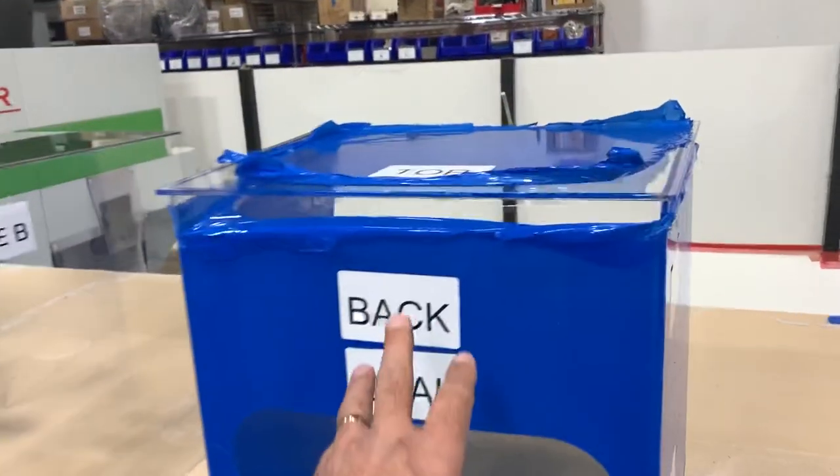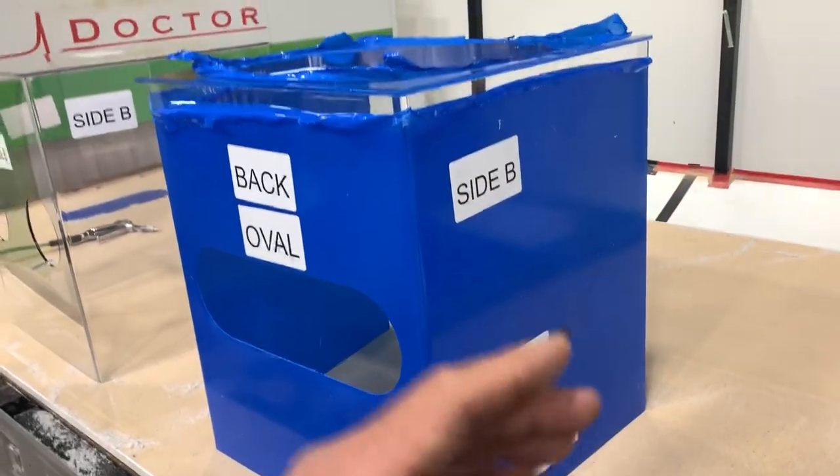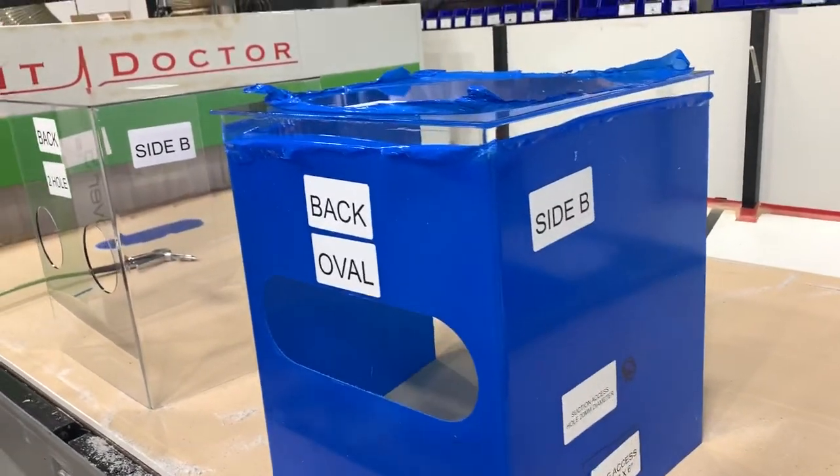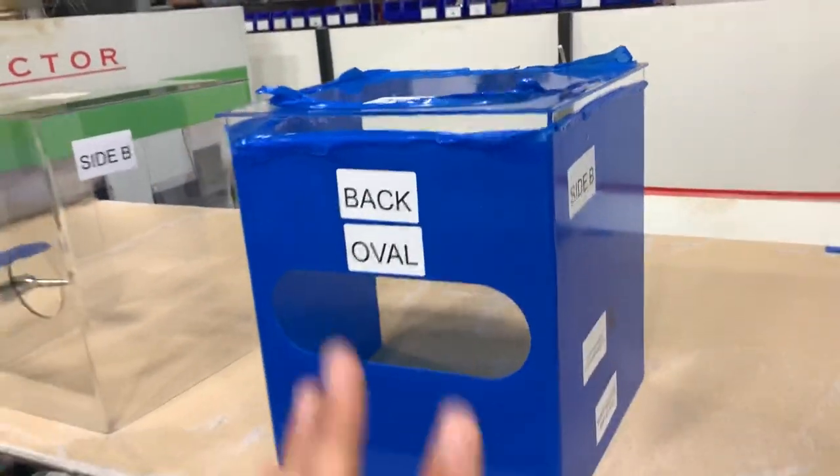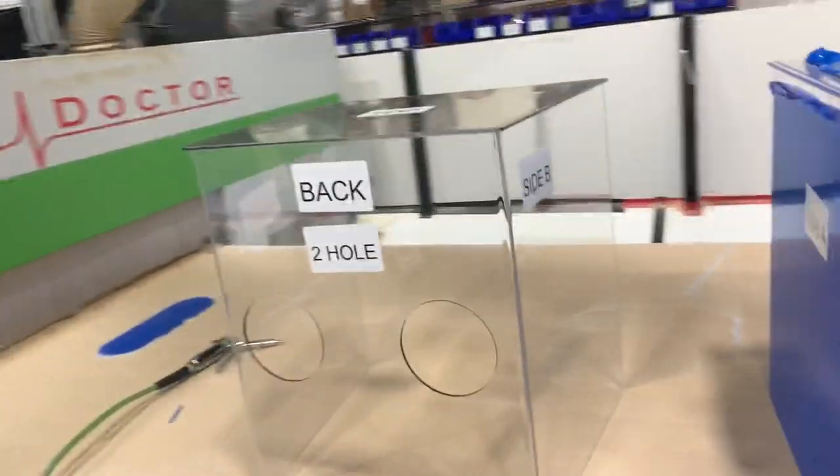I have also labeled it with standard labels. That way, if you're looking at this and you want to add things, you can tell me it's on the top, the back, or on the side, so that when we're talking on the phone we have the same reference.